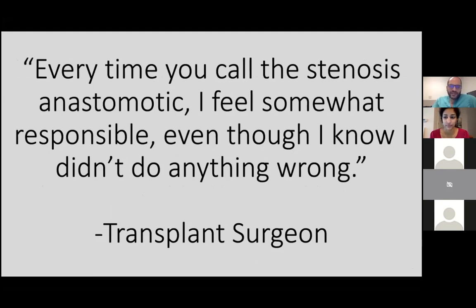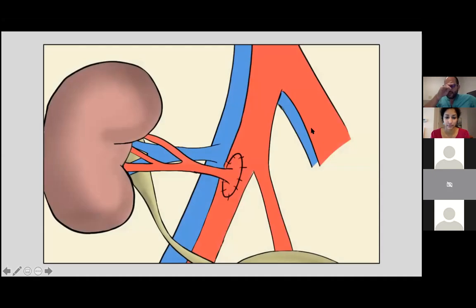So this is one of the things that I was kind of interested in, that the transplant surgeons take it somewhat personally every time you call something anastomotic. And this is based off of some of the radiology literature that's out there that calls most of the stenoses occurring at the anastomosis. So we decided to take a look at it. I worked with a transplant surgeon to take a look at it.